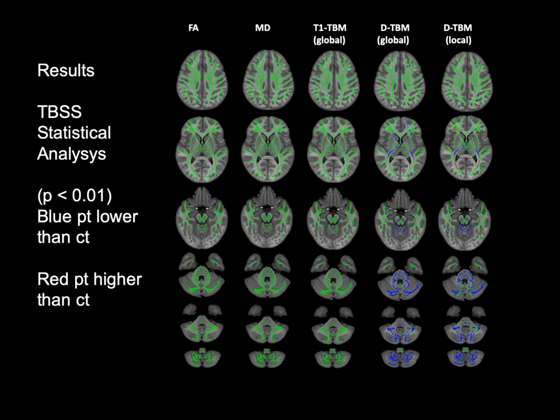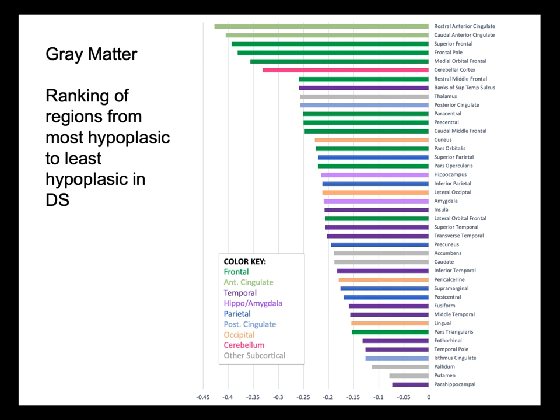So essentially in Down syndrome, it seems that the structure of white matter is not particularly abnormal, but the volume of white matter pathways is horrendously abnormal, okay? And in fact, the DTBM reveals a lot of differences, even in the skeletonized version. Then you can really look at various regions and so on.